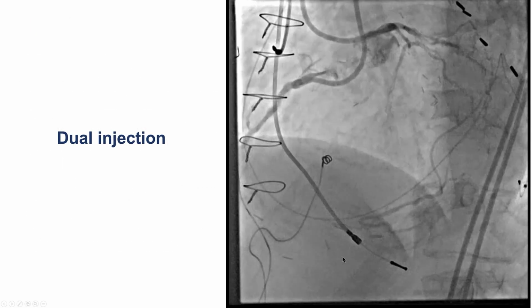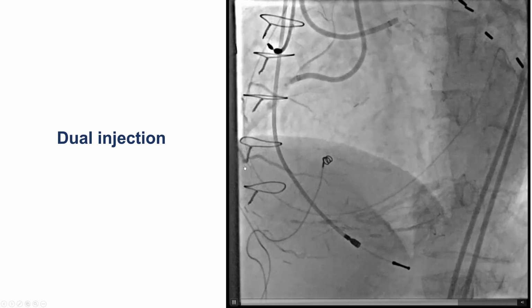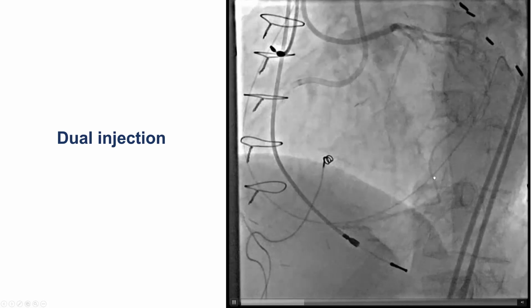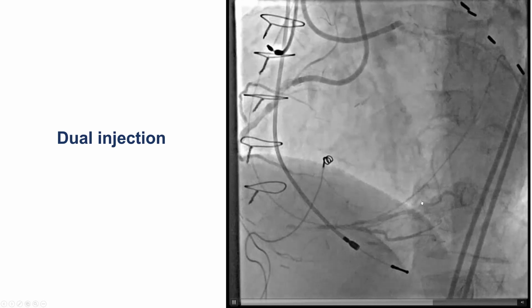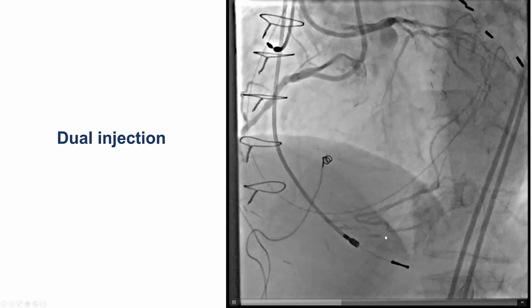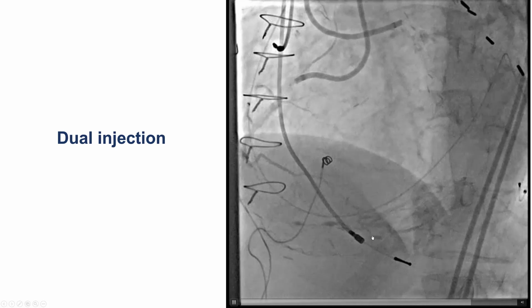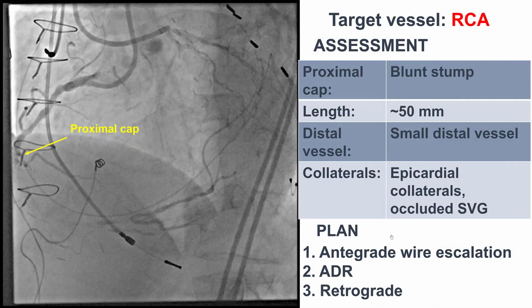This is a coronary angiogram, dual injection, showing a CTO of the mid-right coronary artery, close to the takeoff of an acute marginal branch. The right posterolateral and the PDA are filling through an epicardial collateral. There is diffuse disease distally, and at this point is likely the area where the bypass was anastomosed to the posterior descending artery.